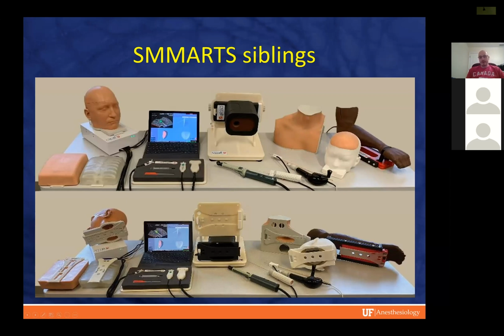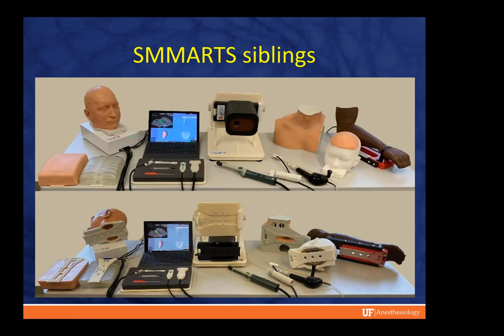This other head is a ventriculostomy simulator. So this one can let the neurosurgery residents practice placing EVDs without having to put a real patient's head in harm's way. And this mysterious looking thing is a trainer that's under development for urologists to perform ultrasound guided prostate biopsies.